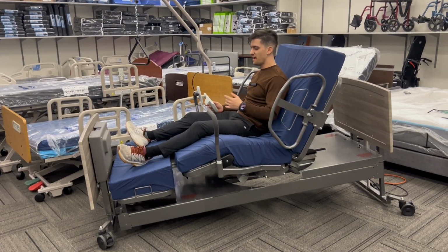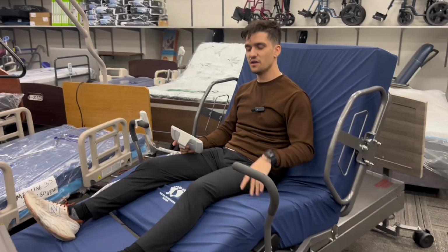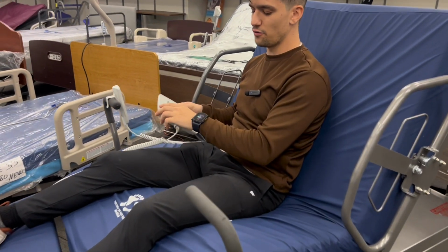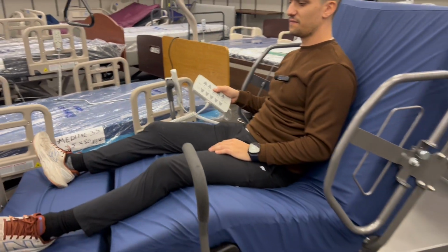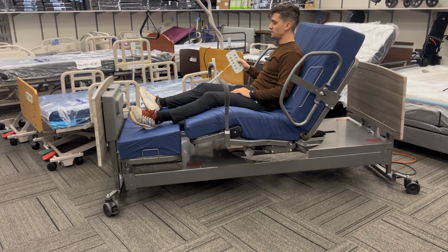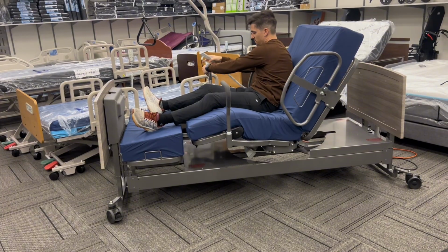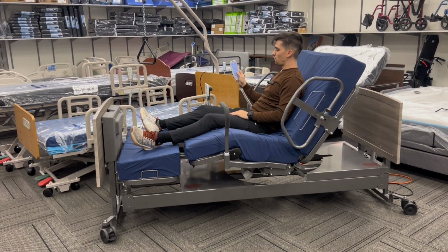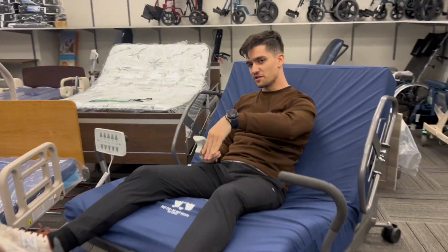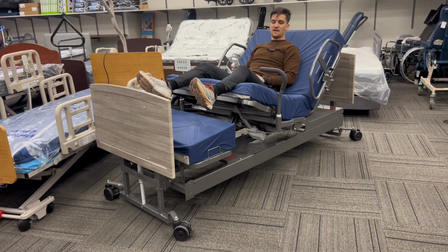Now I want to go ahead and demonstrate how to transfer back. So one of the really cool things is no matter what position you're in with the bed, the transfer will happen and work properly. So right now, I'm going to go ahead and hold that rotate button. As I'm holding that rotate button, and you don't have to do it with the attendant controller, I could simply just swap over right now to the hand pendant. And I'm going to hold the rotate button. It's going to level the bed back out because remember we were reverse Trendelenburg tilted. Lift my legs up. They clear the bed over there, and it's going to begin tilting.